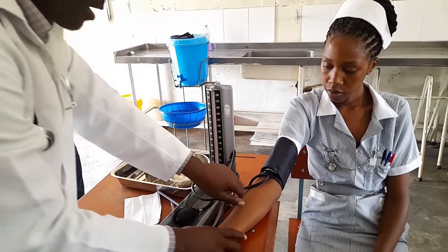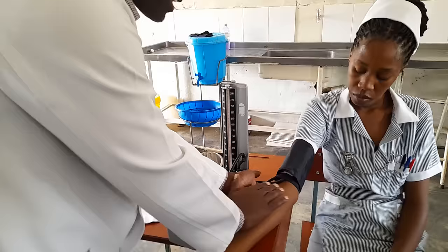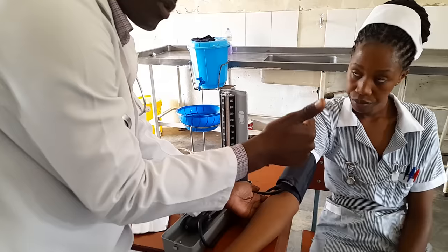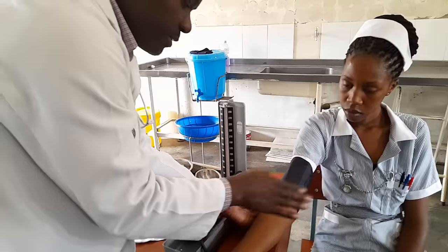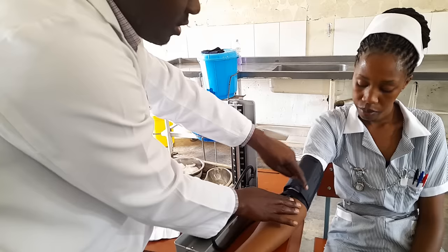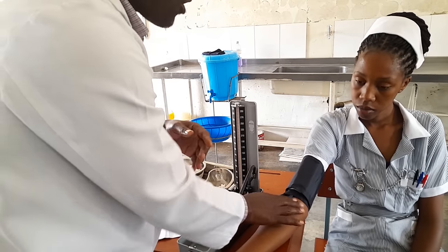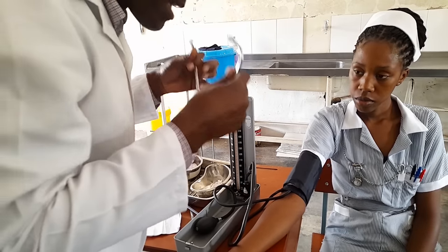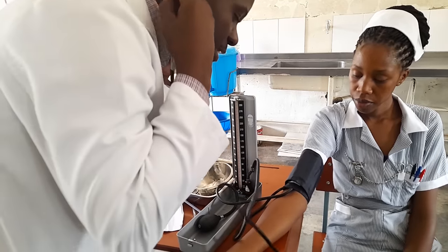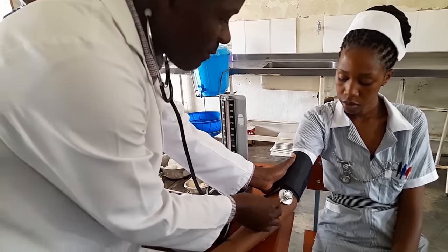The next step is to identify where the pulse is — the brachial artery. You're going to feel here. Don't use your thumb; use your fingers to go there. Once you identify the pulse, it's okay — that's the part where you're going to place your stethoscope to listen to the sounds after you've pumped. Do not put the stethoscope right away and try to feel for the pulse when the cuff is not yet pumped — you can't feel any pulse. Wait until you pump.